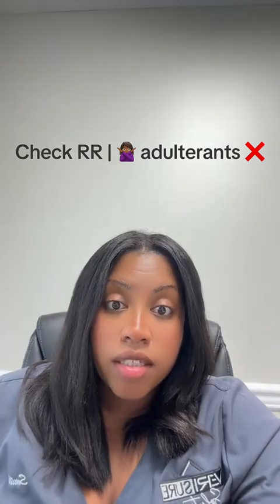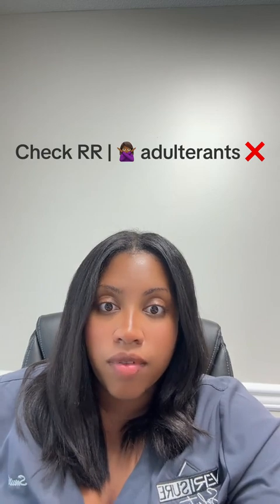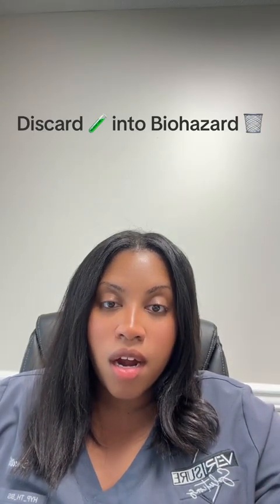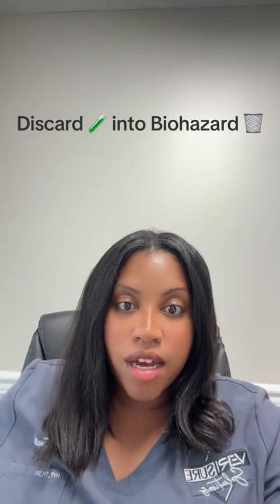You're going to check the bathroom to make sure that nothing was tampered with. They did not turn the water on. They didn't flush the toilet. But again, this is uneventful, so everything should be good to go. Pour out any excess urine and discard the urine cup inside the biohazard trash. It would also behoove you to take off those soiled gloves and put on some new gloves. The donor can also wash their hands. You can flush the toilet.